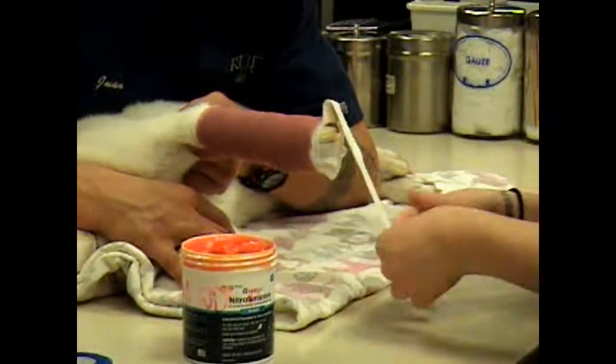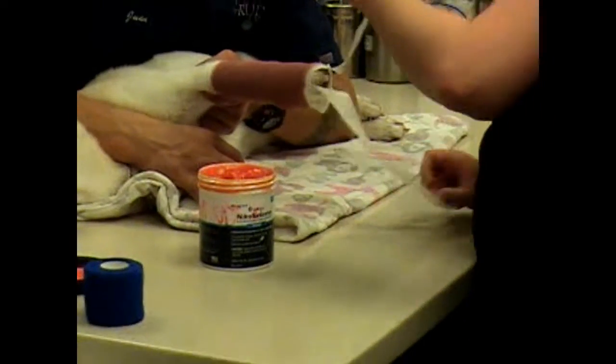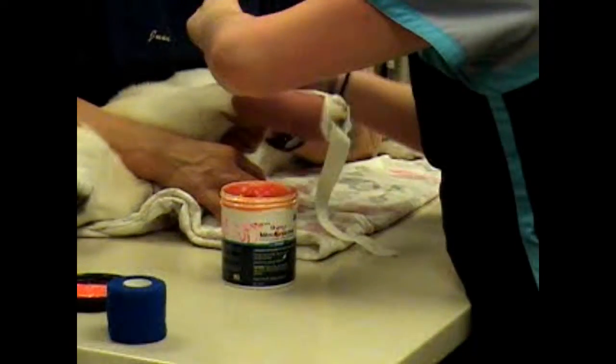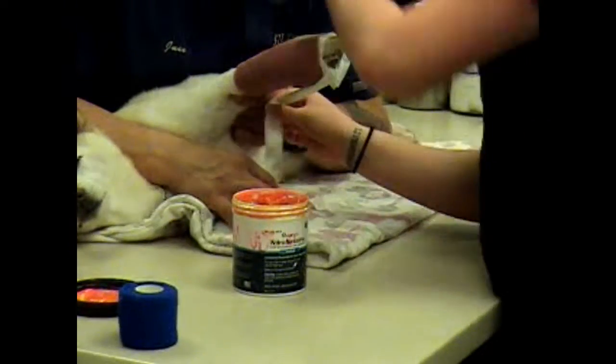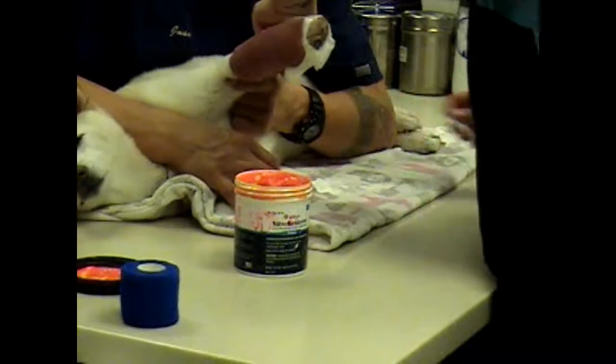We'll go ahead and take our tape stirrups here. This will just help kind of support the bandage as well as not let it fall — if it begins to split, it'll keep it a little bit more in place.